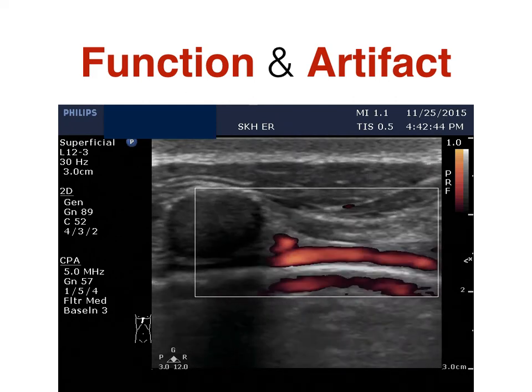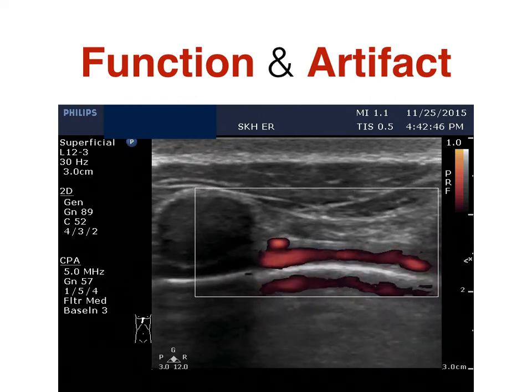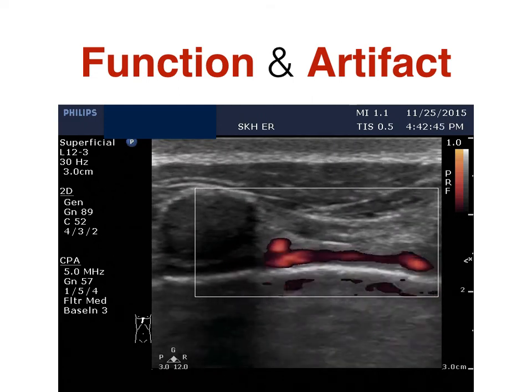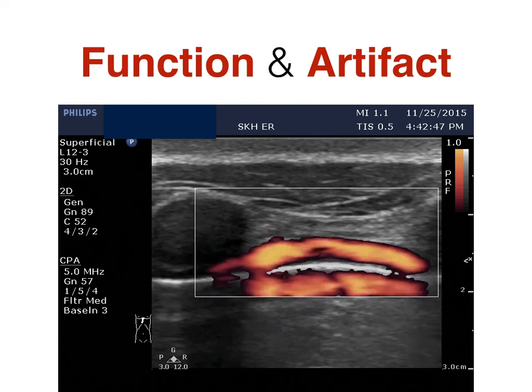What is this kind of artifact? Mirror artifact. Every time you encounter a hyper-reflective surface, you will face the mirror artifact. How to resolve it? Change the direction and change into the other view, and it would disappear.